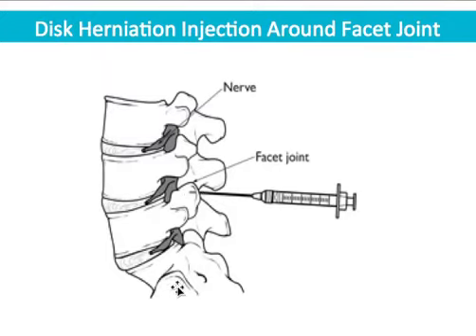The nerves are right around there. So you're going to be going into the intervertebral space, and your needle is going to penetrate for about an inch to an inch and a half. You'll feel some gumminess. Do not do this fast. Go nice and slow and easy. If a patient's super sensitive, you can always use some preservative-free lidocaine. Make sure it's preservative-free, otherwise the stem cells will be affected by it. Numb the area, and then push the needle in an inch to an inch and a half.